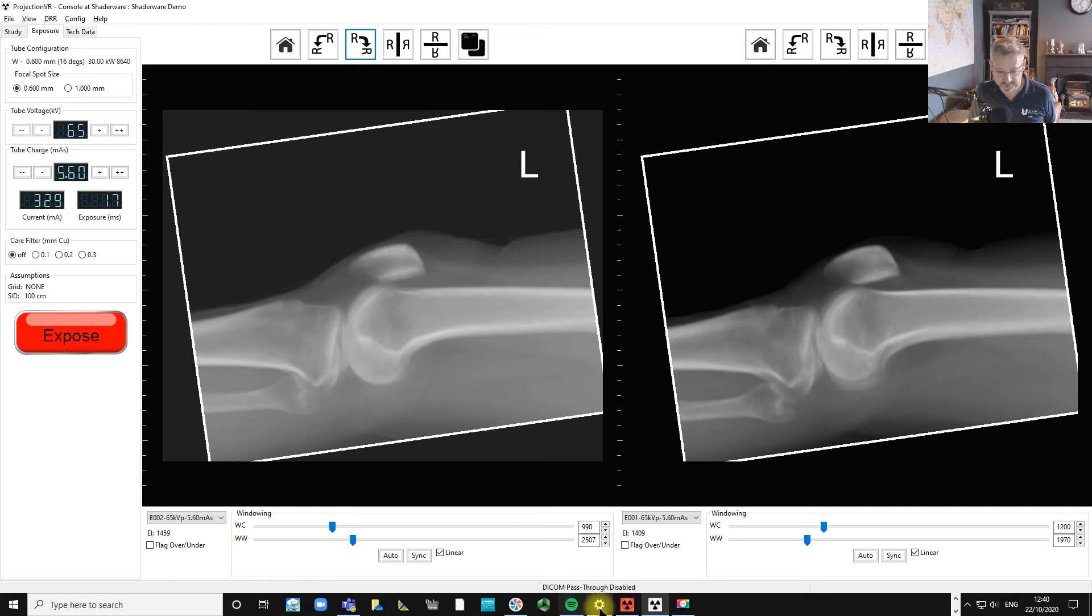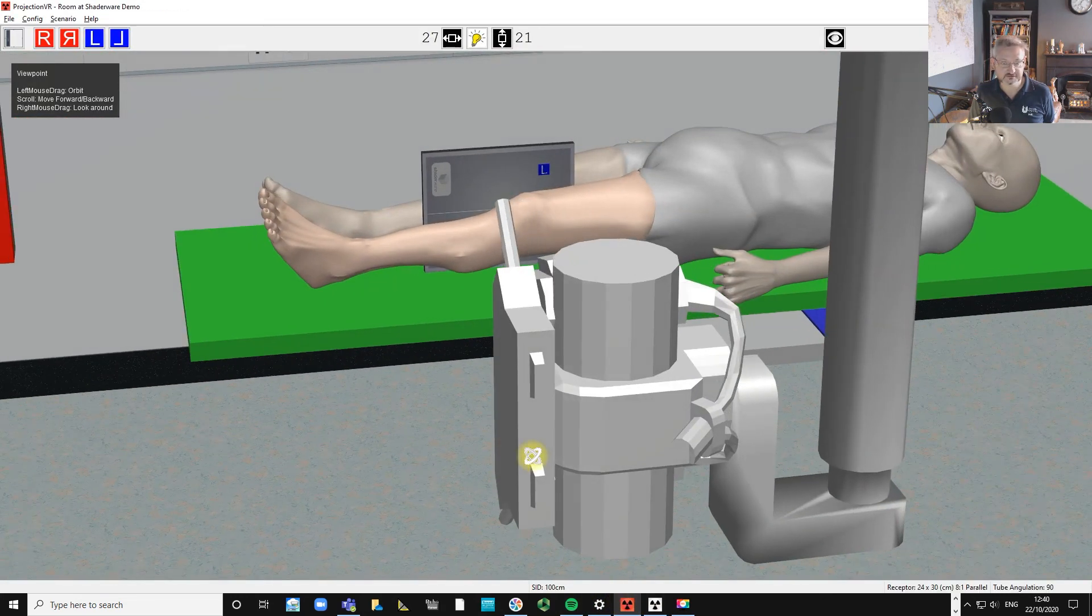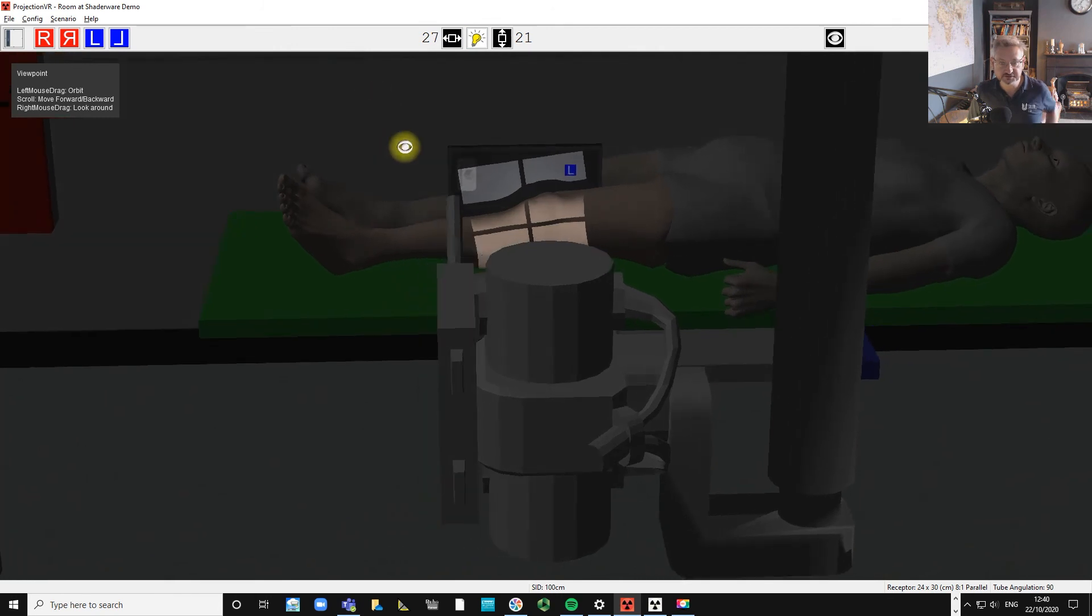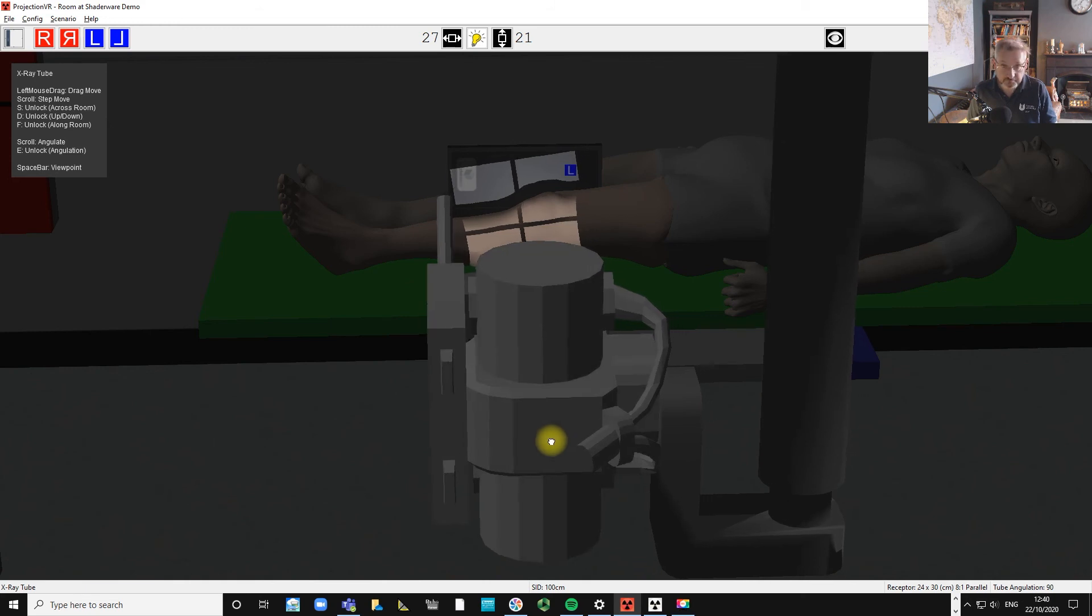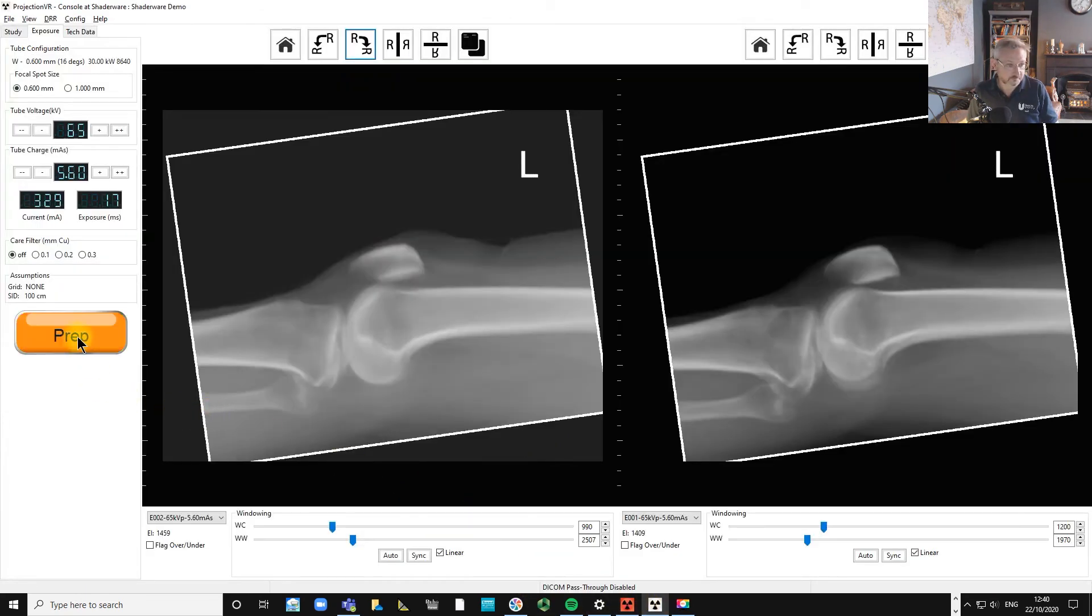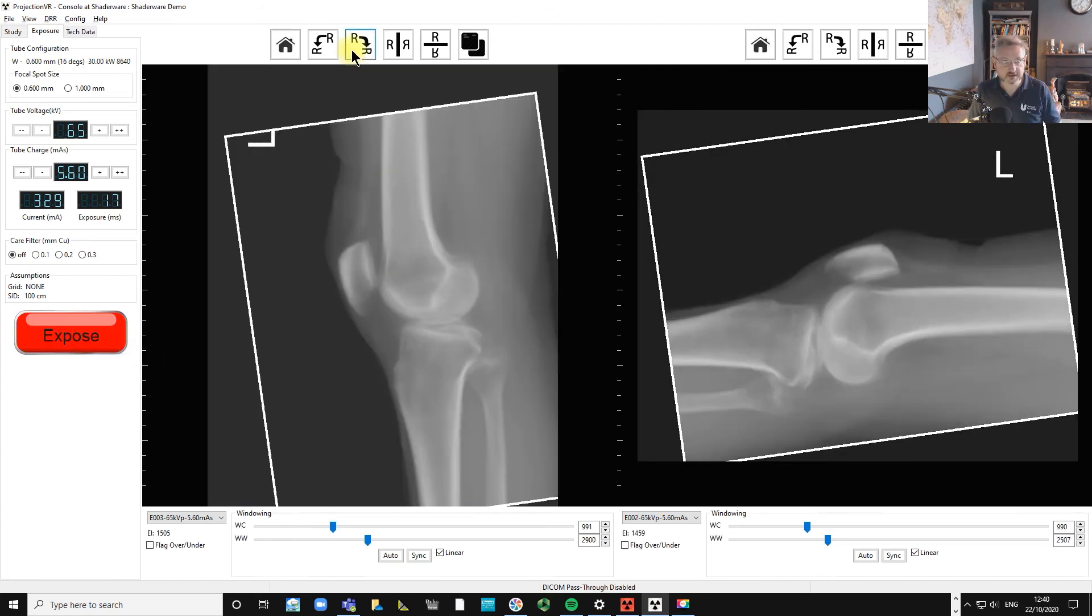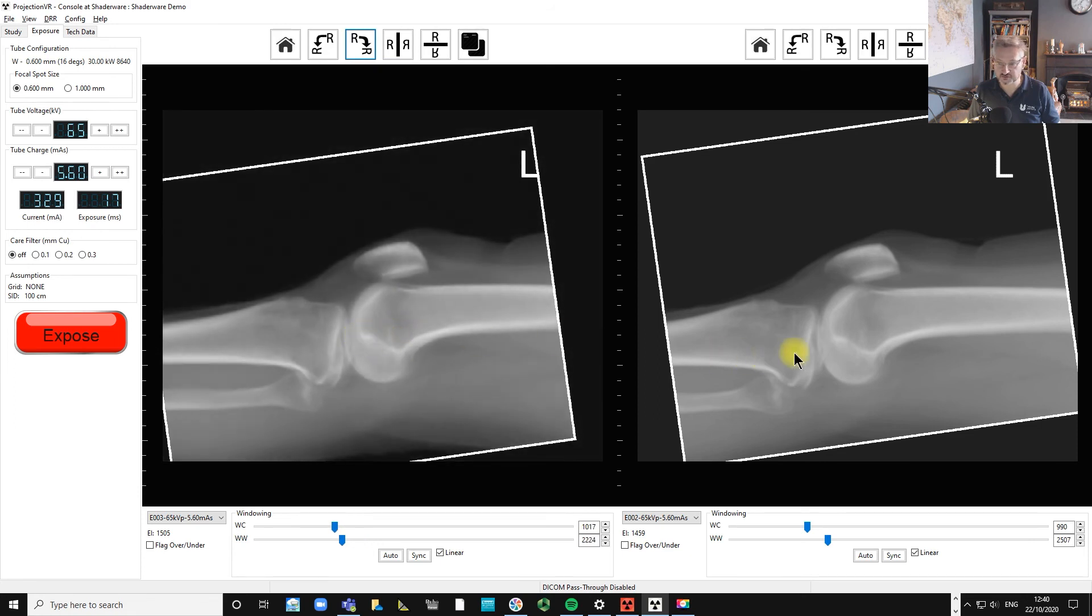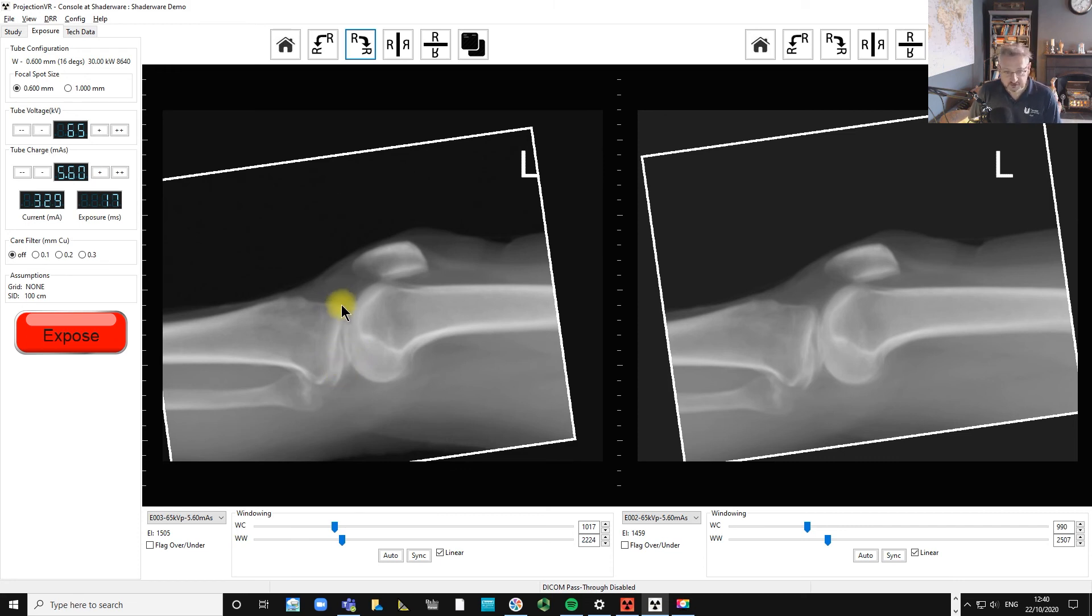So let's just correct that and see whether that has any impact on the joint. We're going to move distally and posteriorly and see what happens. I wouldn't be doing this on a patient because I think that that is a diagnostic image. We're just seeing what difference it makes when you actually center in the joint space compared to a little bit high and a little anterior.